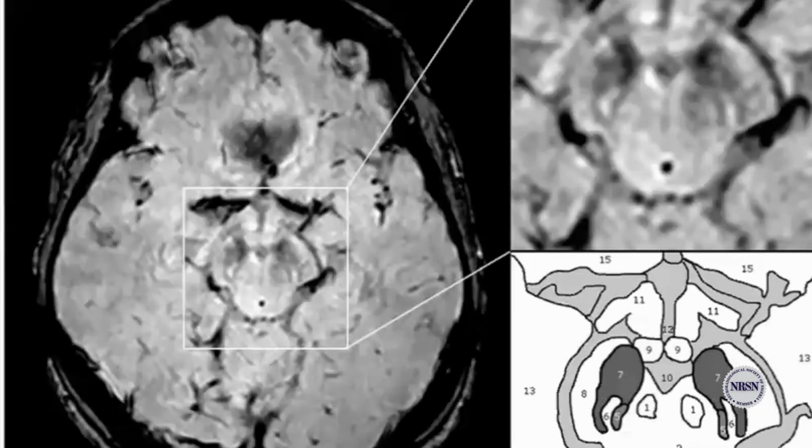So this is an image of an SWI image for Parkinsonism. Now in healthy individuals, we typically see what's called the swallowtail sign. This is a normal sign. This is the normal imaging appearance of the dorsolateral part of the substantia nigra.